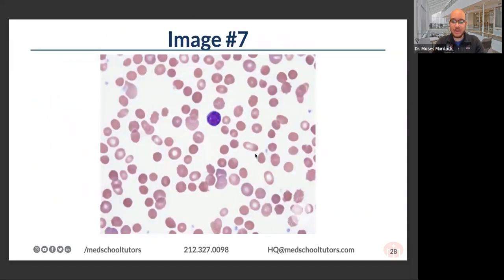All right, here we have another blood smear that is abnormal. And now I will point out, because there's a couple of different things here. What I want you all to focus on is the fact that there's a bunch of these cells that are maybe slightly smaller, I'm pointing them out with my cursor, and they don't have any central pallor, okay? And while you all are putting in the chat what the name of this abnormal red blood cell looks like, I'll just point out that this slide has this cell over here that's a bit larger. It's deformed, it's a bit larger. And maybe this one up here, they're larger and they tend to be slightly bluer. That's probably a reticulocyte, right? An early red blood cell.